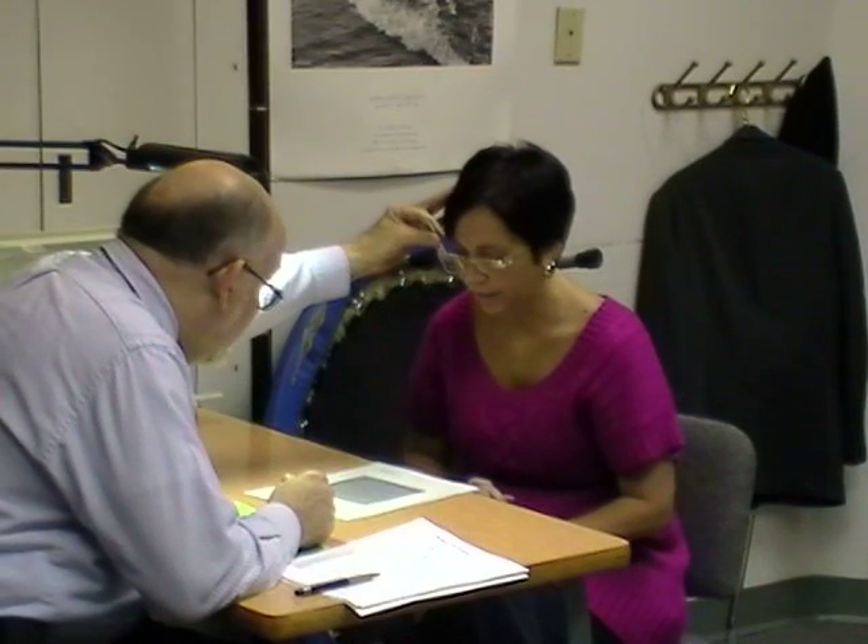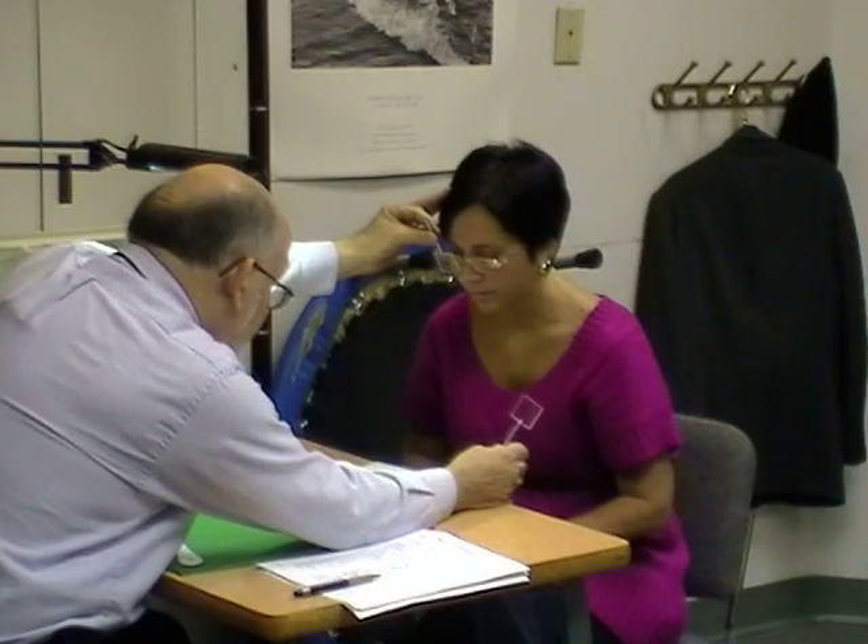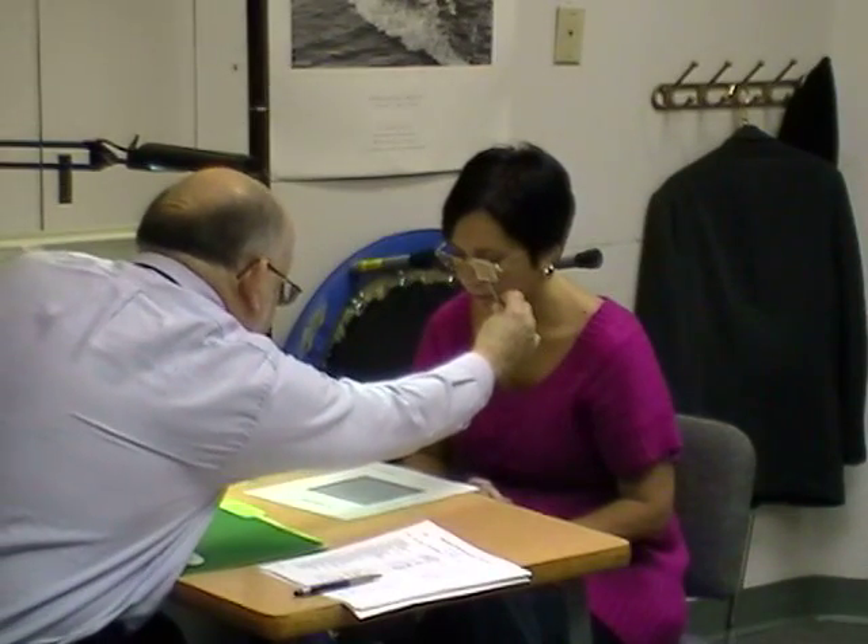Now leave that up. We're going to put a one prism over top of that. Does that improve it further? Yeah, a little bit. That does — it makes it better. That's a one. This is a one half. That helps too. Which of the two is perceived better? The half? Or the one? I think the half. So you're that sensitive. You've got a one on each eye, so one and a quarter would actually be a better lens for you.